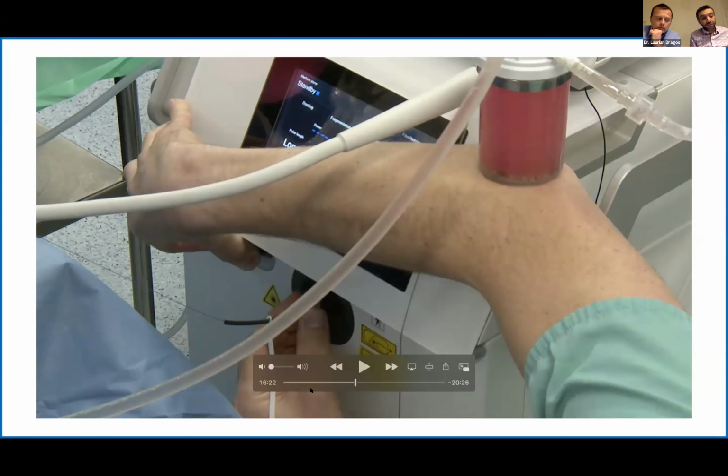I think those are very valid points and very true. But I think what's more important is what the surgeon and the center is comfortable with. There are some centers that continue to do 30 French and they're very good and they get very good clearance. So it's important to do what you're happy and comfortable with and confident with, rather than just using technology to improve you. Technology is there to help you improve things, provided that you're happy with it.